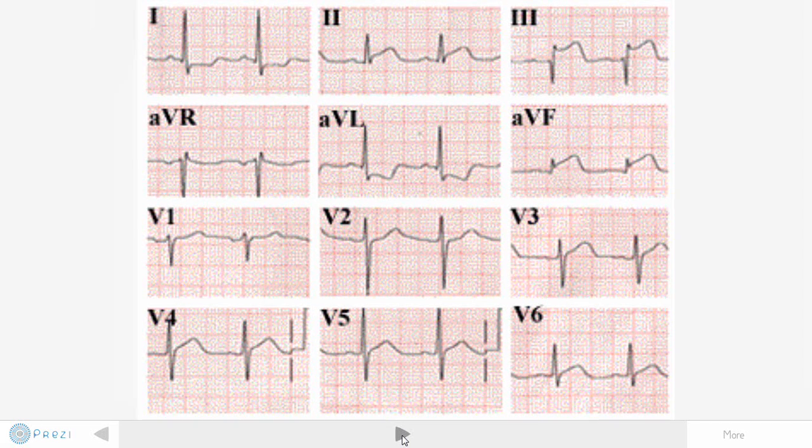So normally, an ECG trace will include all 12 leads as separate traces. All of the traces show the same electrical signals, but they are all seen from different angles. By knowing how the trace of a healthy heart should look, anything which differs from it could suggest an abnormality that should be treated.